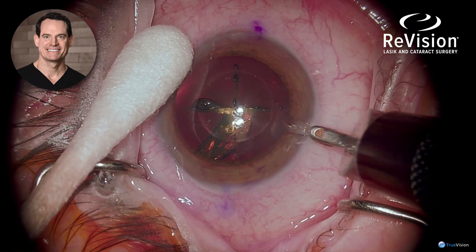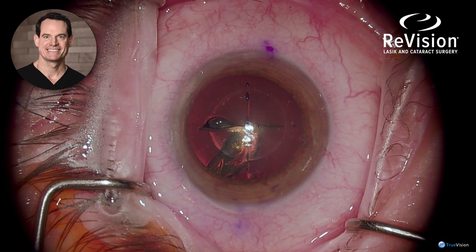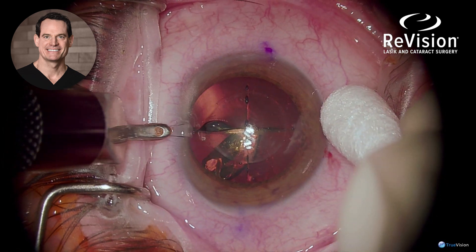This is a femtosecond laser-assisted cataract surgery with an advanced technology intraocular lens and extended depth of focus.